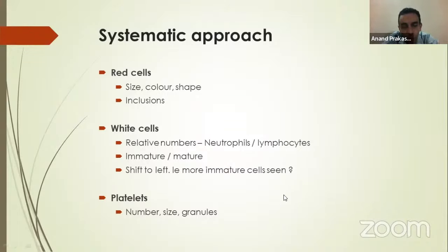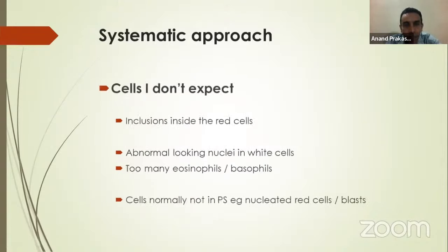So a small blood clot in the sample can falsely drop the platelet count number. So correlating the history is important. Otherwise, if you just look at the platelet count and say, oh, this child has one day fever, low platelets, I'm thinking of dengue, when it's not really dengue, that's not good clinical practice. So for the clinician, it's very, very important to put everything together.